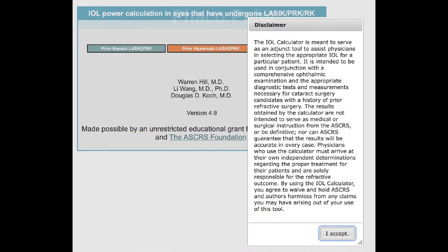The next document is extremely important. It is a disclaimer stating that this IOL calculator is only meant to work as an adjunct tool to assist the physician in selecting the correct IOL power. It needs to be used in conjunction with a thorough eye examination along with appropriate diagnostic tests and measurements. The surgeon who chooses the IOL power is completely responsible for the end result.